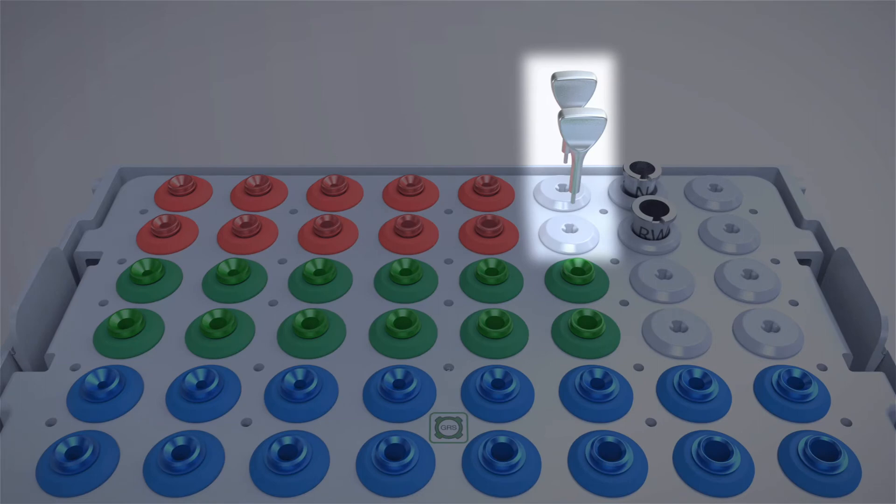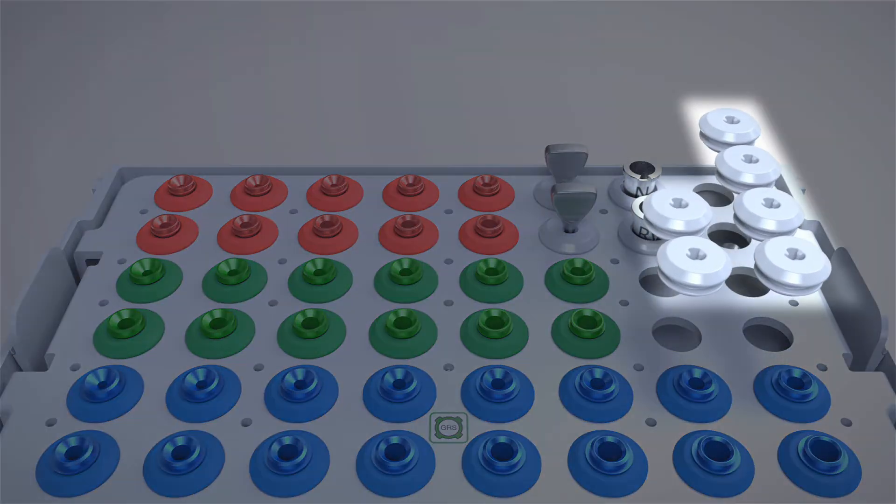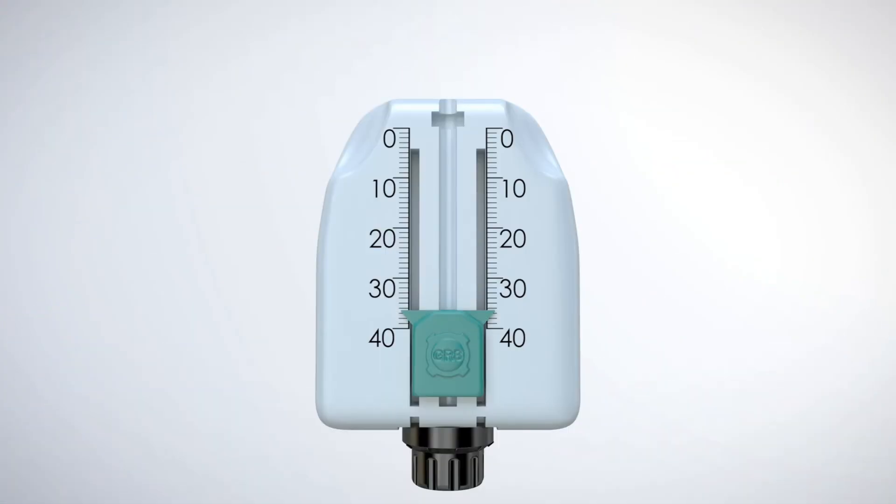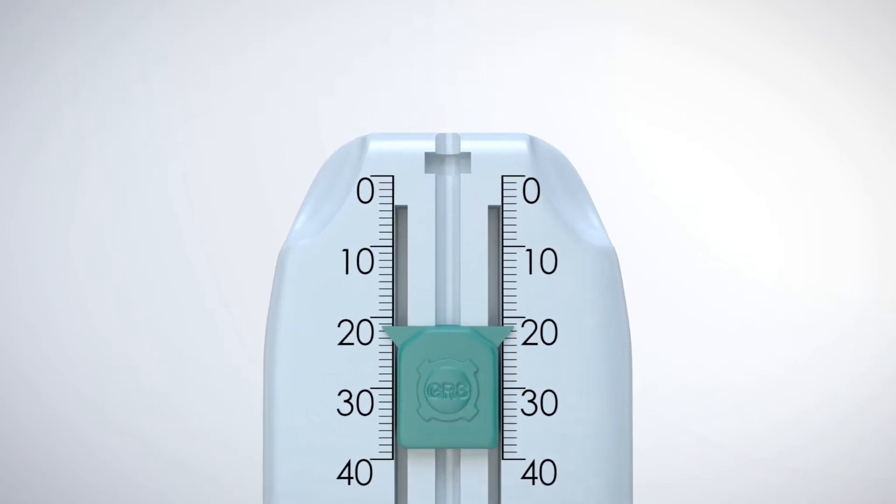Drill stop drivers firmly secure GRS adjustable drill stops to any diameter surgical drill. Spare grommets are conveniently provided for additional surgical instruments. The adjustable GRS drill stops are numbered to match a specific diameter surgical drill and GRS drill sleeve.